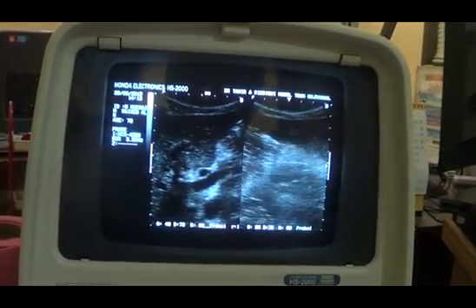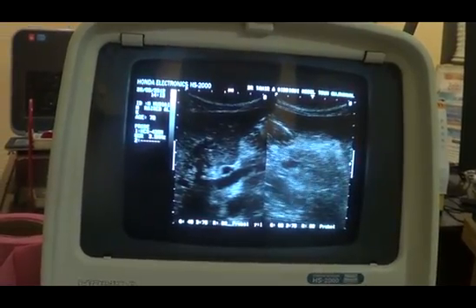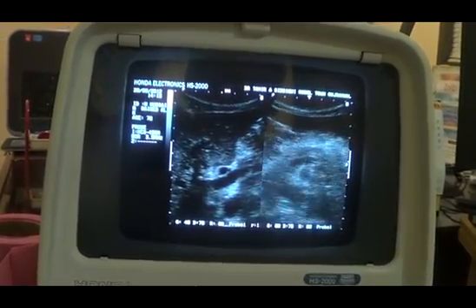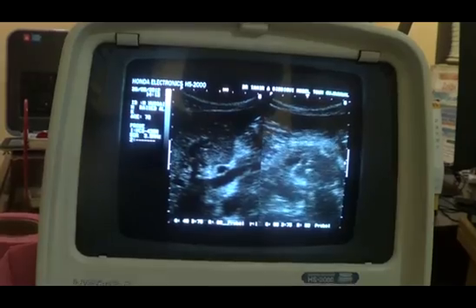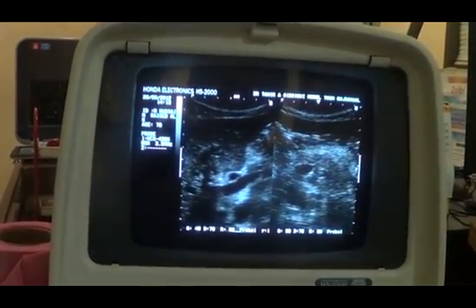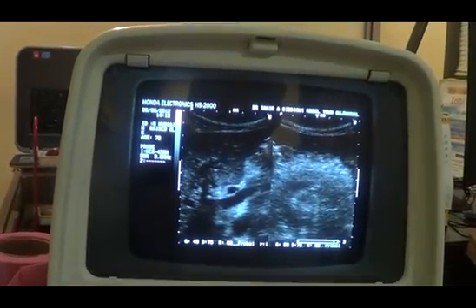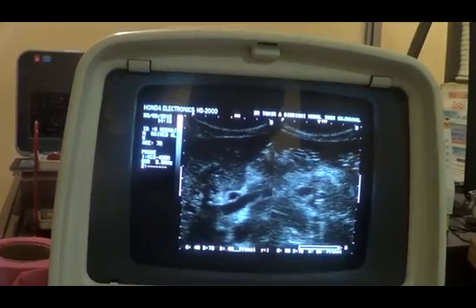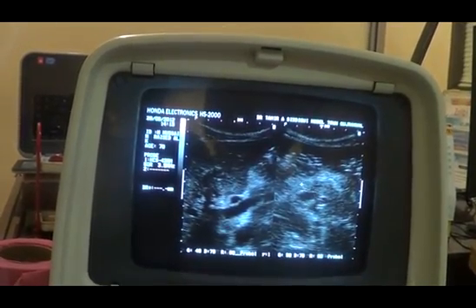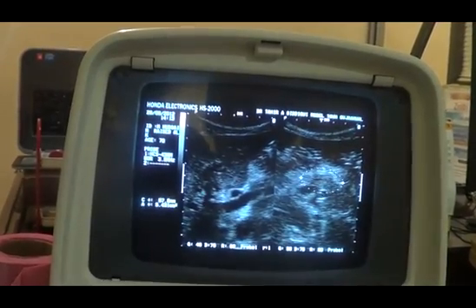As the age advances, we know that the pancreas goes fatty, but in this case I am not seeing a fatty pancreas. If this is the pancreas, now this is the pancreas, body of the pancreas, this area.